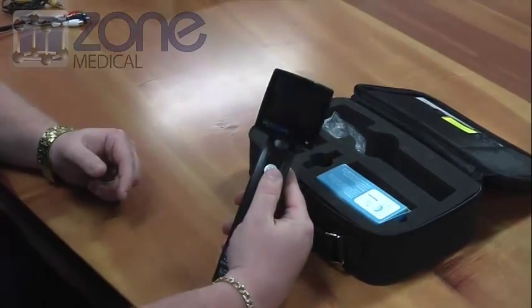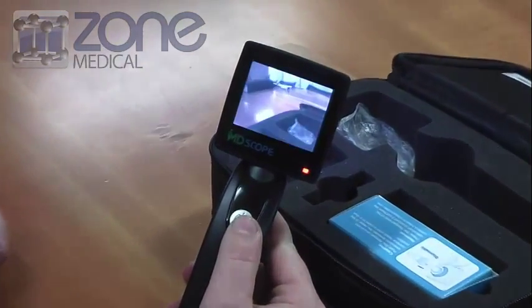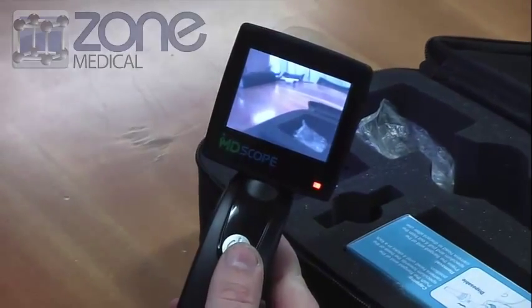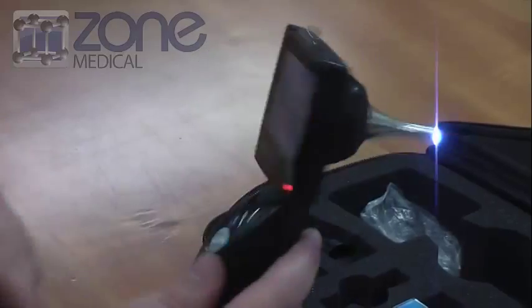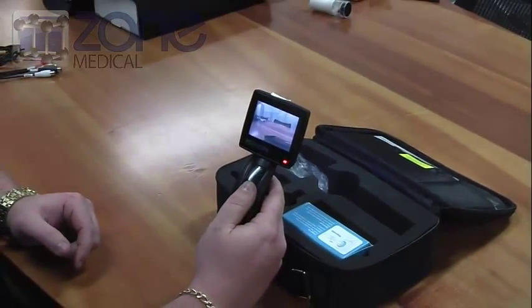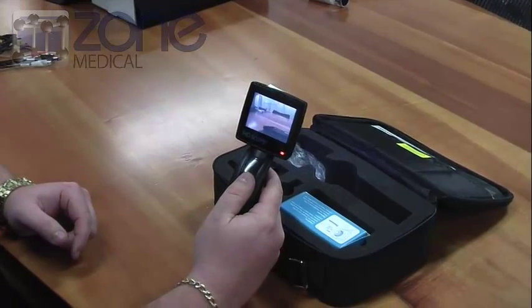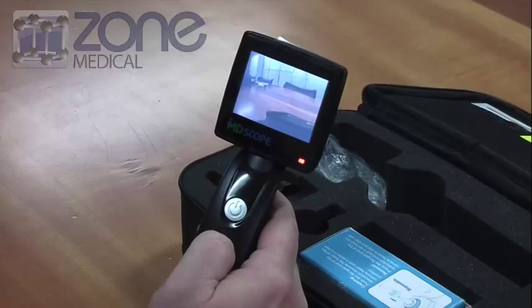The device has a single power button on the handle. Press and hold — the display will power on and the light will turn on at the tip of the camera. Simply to take a photo, all you need to do is press the power button once and it will take a basic snapshot.